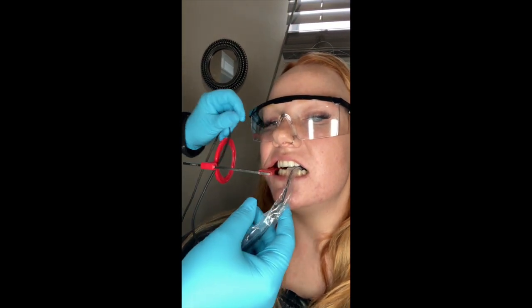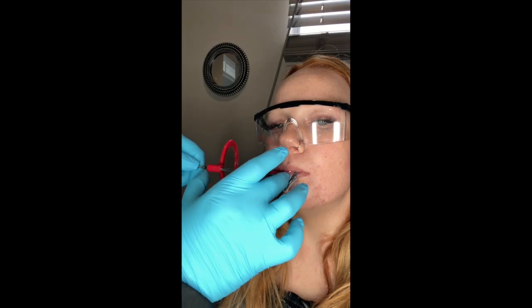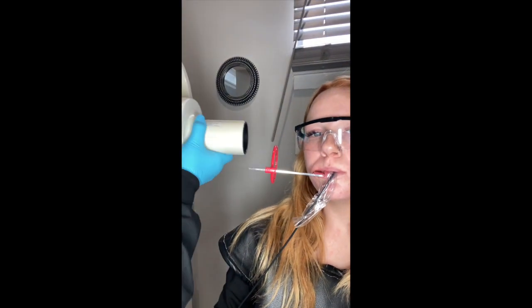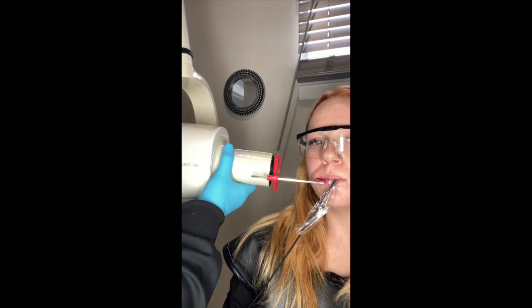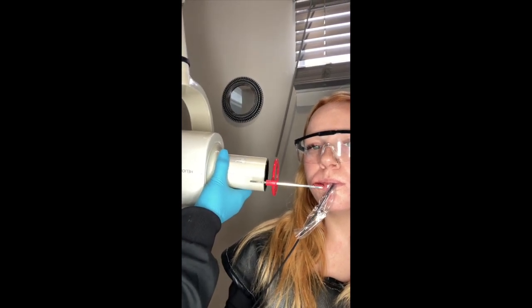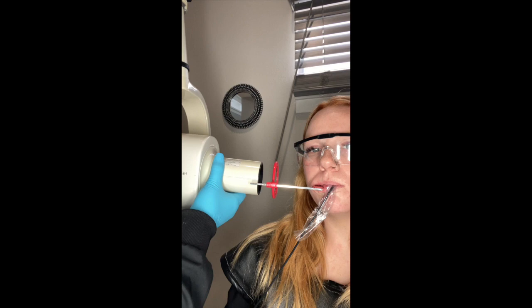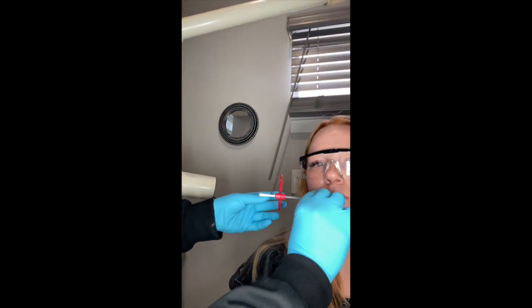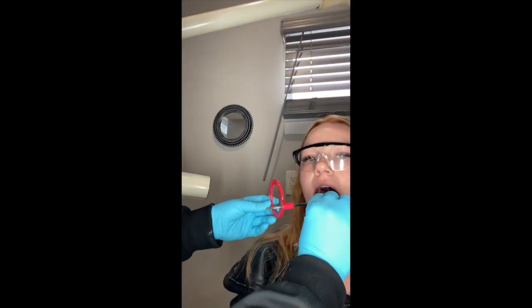Very straight. Get the cord out of our way, we're going to close this as much as we can. It's going to stay right here — that's our placement for our molar shot. Come back, move this away, have the patient open. I'm not going to take it out.